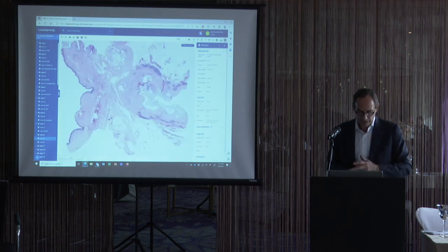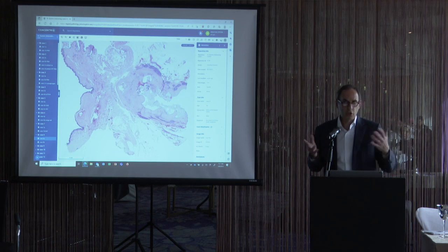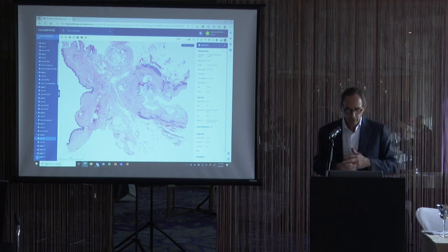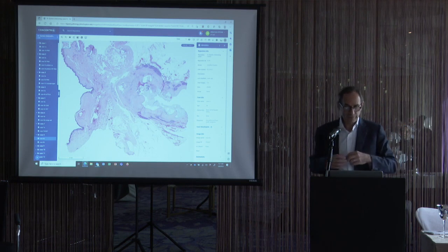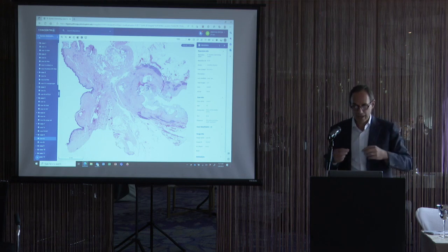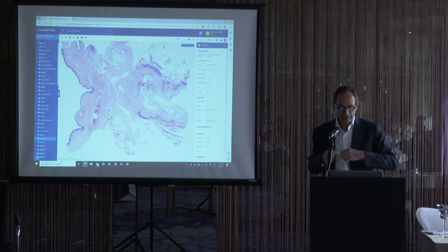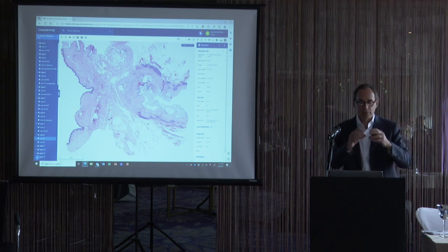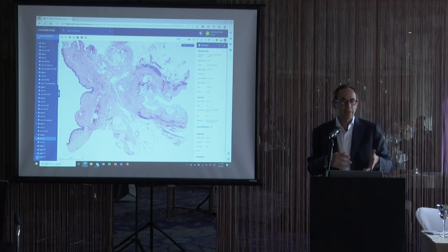This is the mass at the dome of the bladder. When you're in the dome of the bladder, you have to think of potentially urachal lesions. We used to have a urachus that went basically up from the fetus to the umbilicus. When you're an adult, that tract becomes scarred down. It turns into the median umbilical ligament. But we can sometimes still have little urachal remnants, sometimes urachal cysts, and sometimes we can get tumors arising within these urachal remnants.